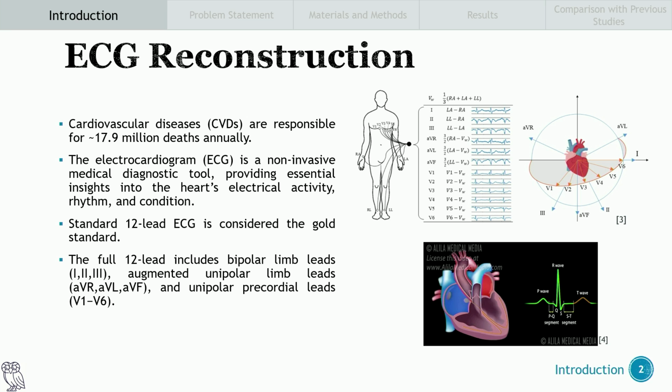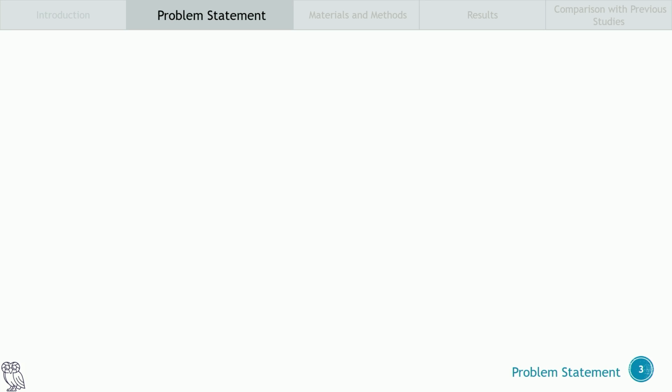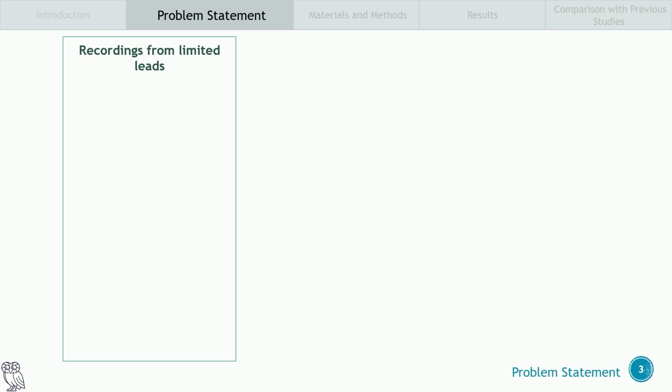And we have a lot of personal devices that, if you think about the long term, if we could get this helpful data from those personal devices, it's going to be very helpful for people to have their personalized heart monitoring device. So a lot of researchers have asked, can we get this helpful information for cardiologists from a limited number of leads with an easier setup?